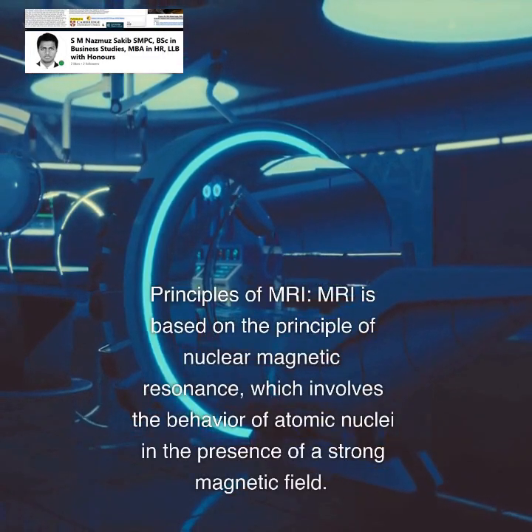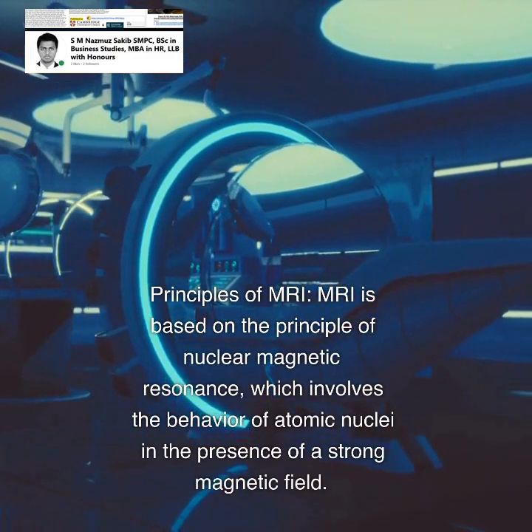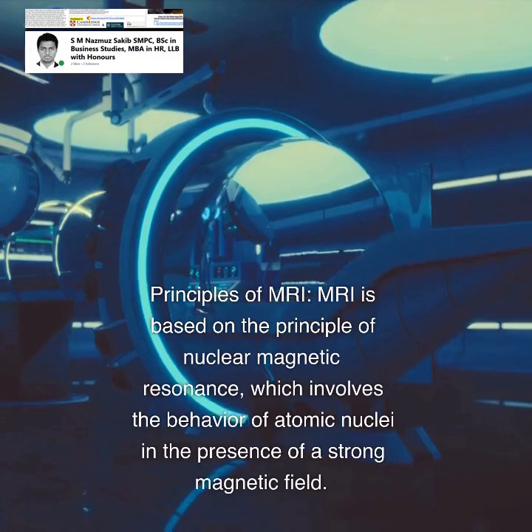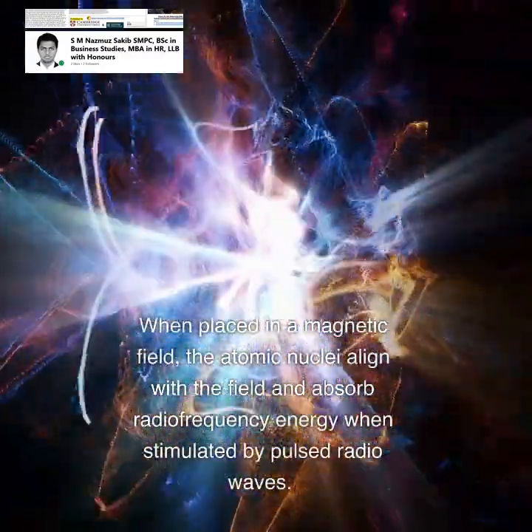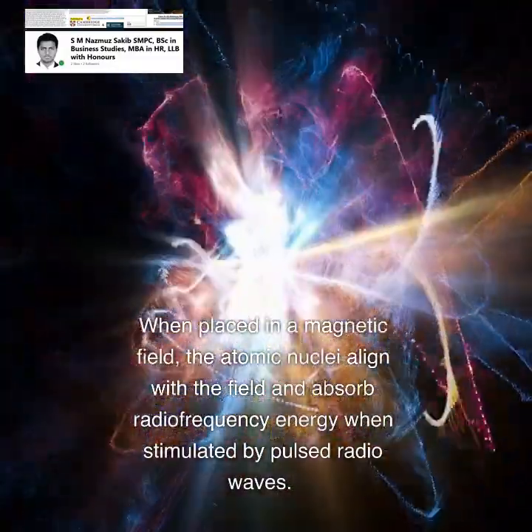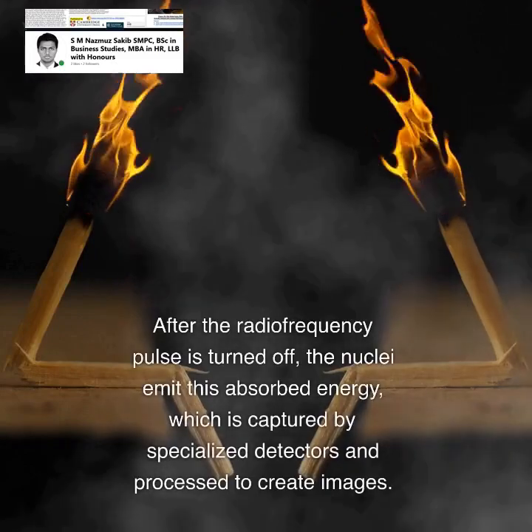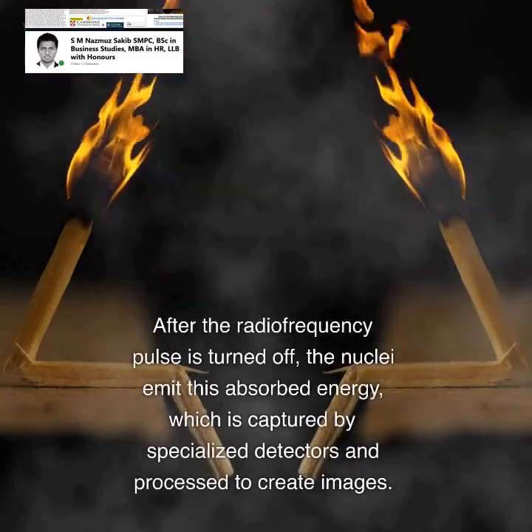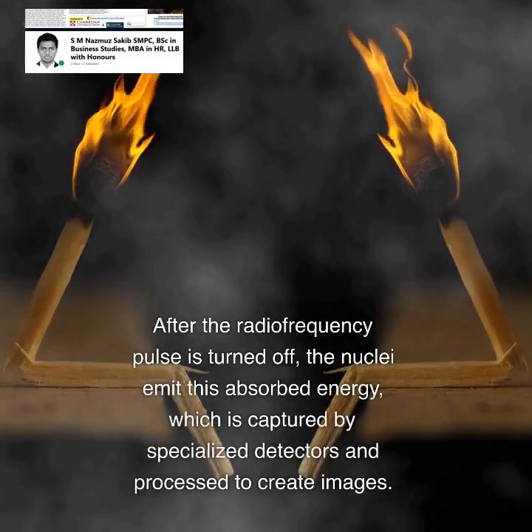Principles of MRI. MRI is based on the principle of nuclear magnetic resonance, which involves the behavior of atomic nuclei in the presence of a strong magnetic field. When placed in a magnetic field, the atomic nuclei align with the field and absorb radio frequency energy when stimulated by pulsed radio waves. After the radio frequency pulse is turned off, the nuclei emit this absorbed energy, which is captured by specialized detectors and processed to create images.